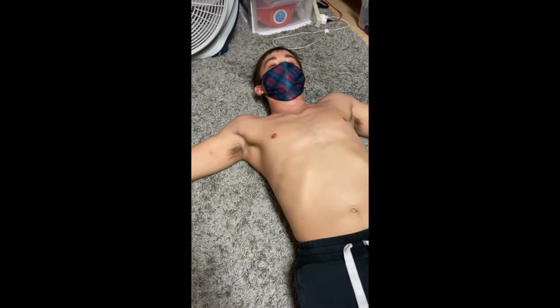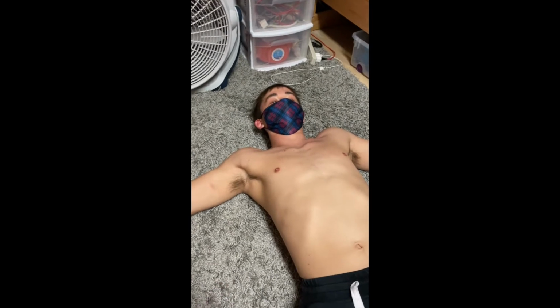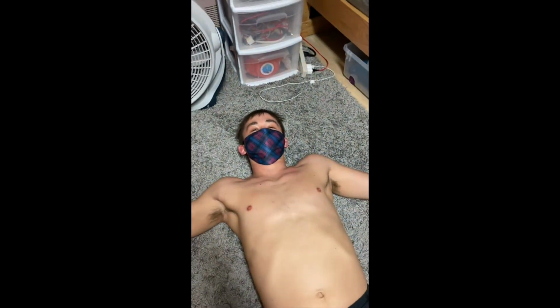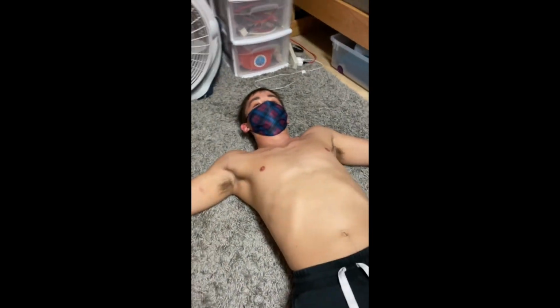Hi, I am IPH-418 and this is my video for the 12 lead EKG placements for Lab 3 of EKG 418. I have with me Josh, and I'm going to be demonstrating on him today. He's wearing a face mask, and so am I.